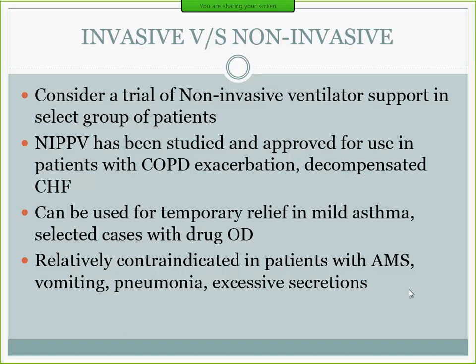Also, just a few words about invasive versus non-invasive. We should try to avoid mechanical ventilation in most patients. Try to use non-invasive if you can. Certain conditions where non-invasive ventilation has been studied and shown to be very effective are CHF and COPD. In these conditions, there is no rush to intubate the patient if you can manage them with non-invasive ventilation.